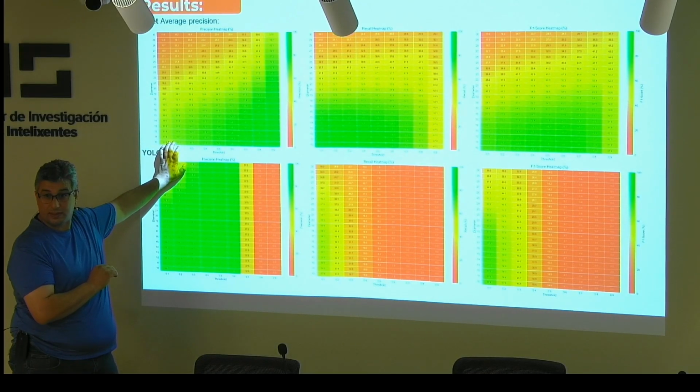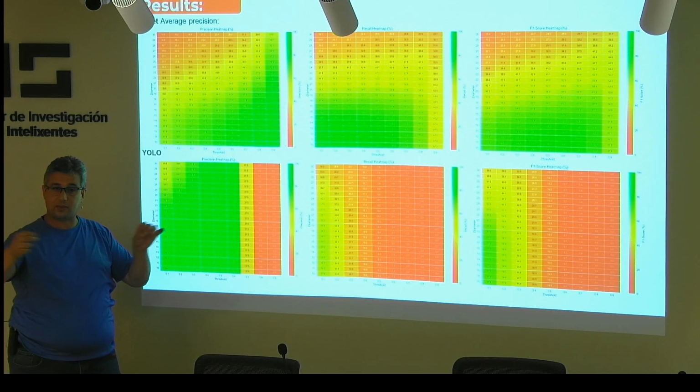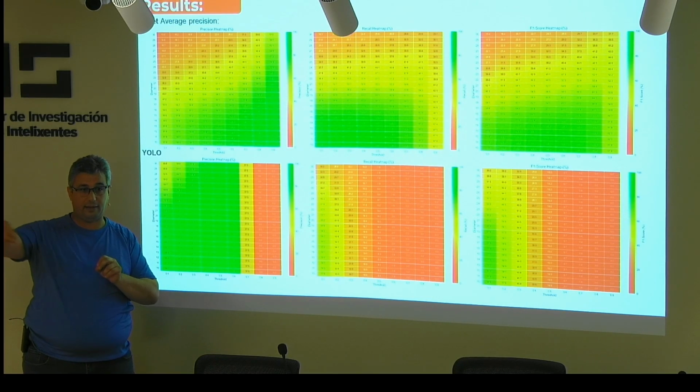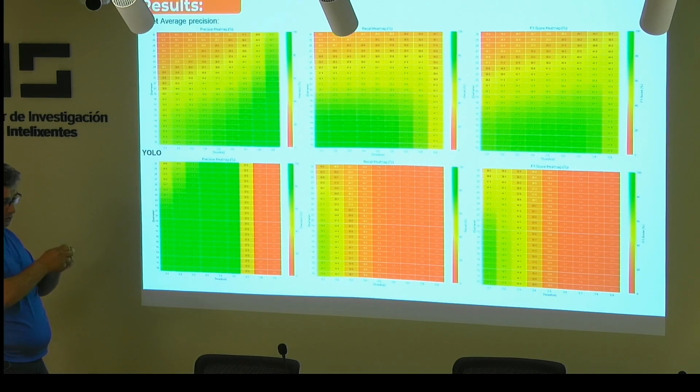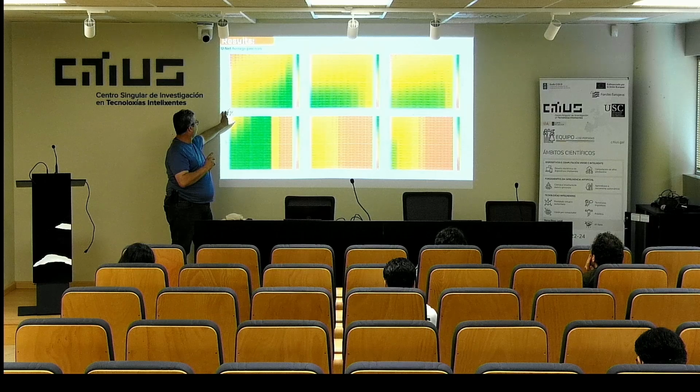We can use it. And this is the diameter, to check the distance between the centroid of the cell and a radius for the cells. Each value here is the average over all image patches, depending on this threshold and this diameter.